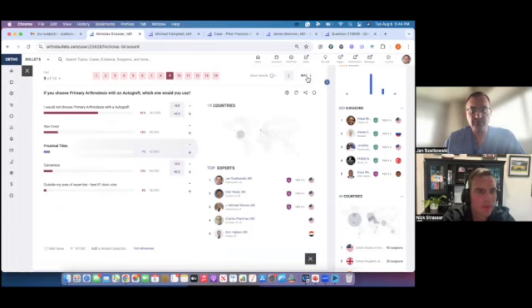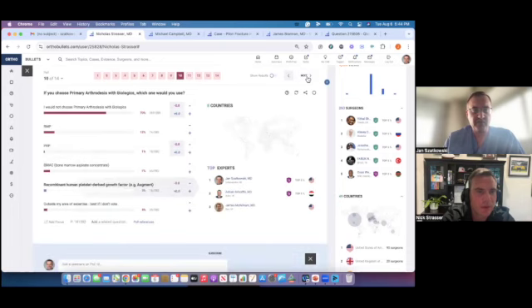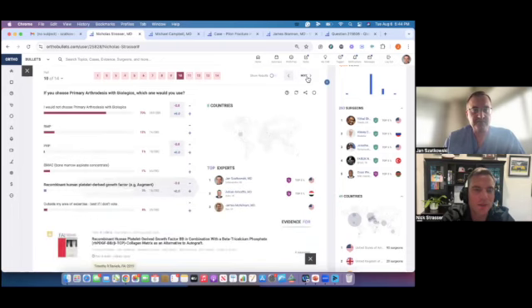So this was a little bit all over the place too, in terms of where you're getting the graft from. You don't need a lot for this, so I think going to the calc is a great option for something like this. It takes a couple minutes, and you can get enough graft to fill those defects.